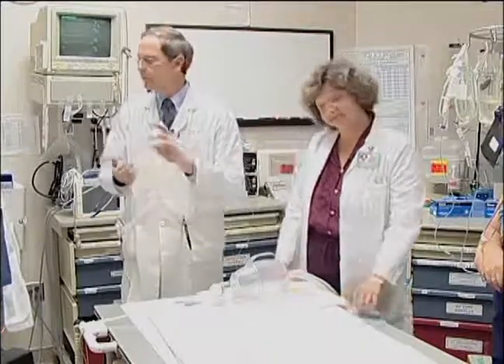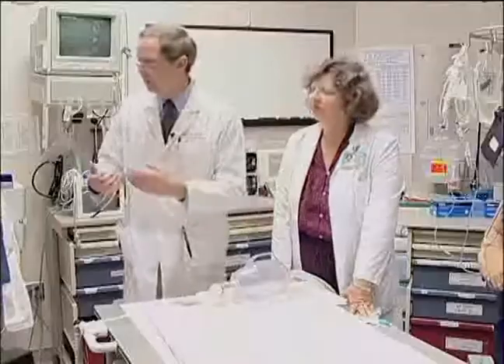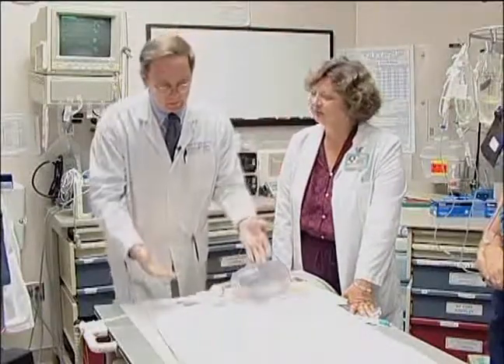So for those of us who are going to intubate, we need to have our suction catheters, our laryngoscope, our endotracheal tubes, our stylets, our ambu bags, our nasal trumpets, all our adjuncts to go ahead and bag the patient and hyperoxygenate them before we actually begin this. We also need to make sure that the nurses have the appropriate drugs that we need for the patient. You guys are at the ready with the ventilator, the ambu bags, the suction catheters to assist us in doing this procedure. So we go ahead and decide to intubate the patient.